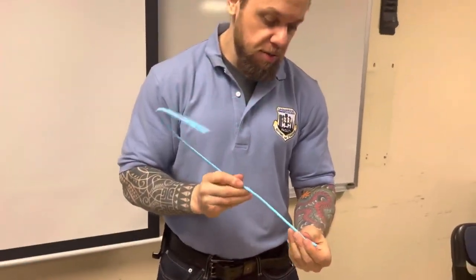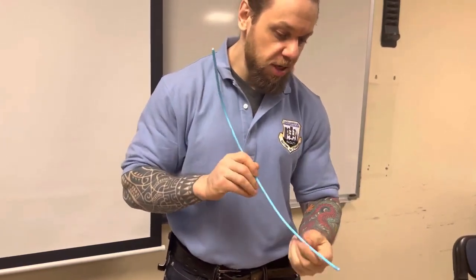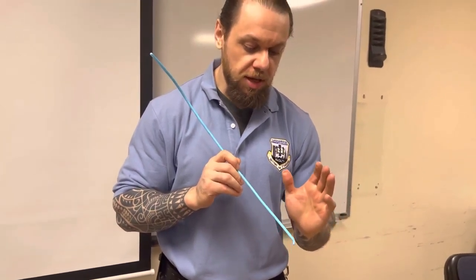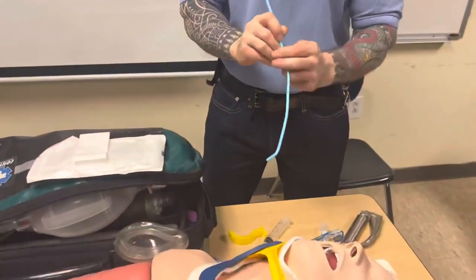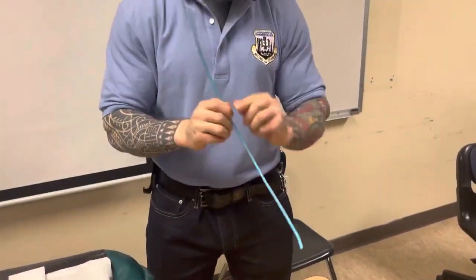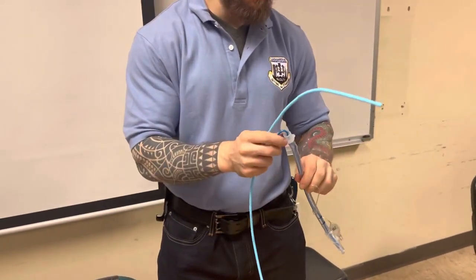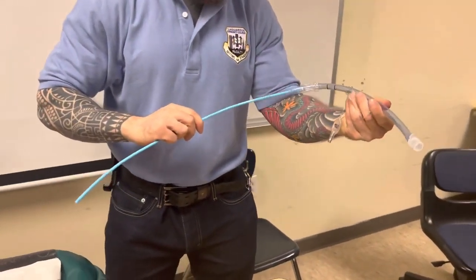And I know some of the videos or some of the instructors will say you want to feel the rings. Truly speaking, the best landmark to know that you're in the right place is you're going to get hold up. This is not going to advance because you're going to hit the right mainstem, it's going to stop. If I was in the esophagus, this would go down all the way. So hold up is the best marker. And then we're going to lace the tube over it. So here, this is straight to cuff, but we're actually not going to use the stylet. We're basically going to use this to railroad it over.